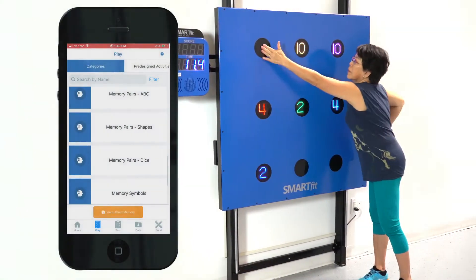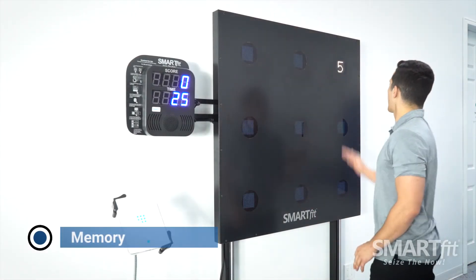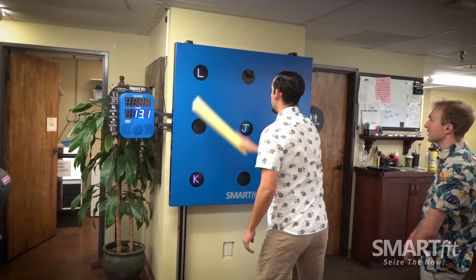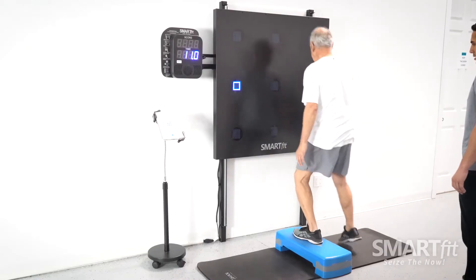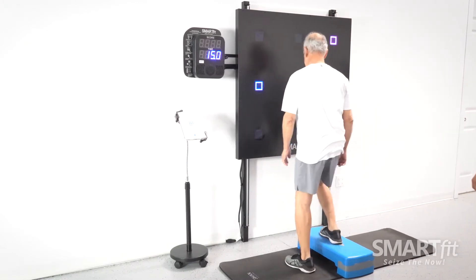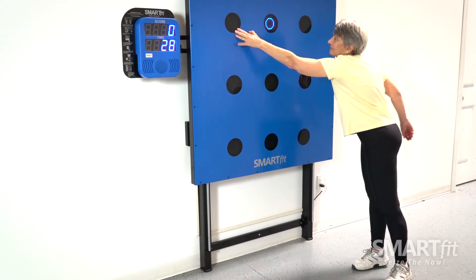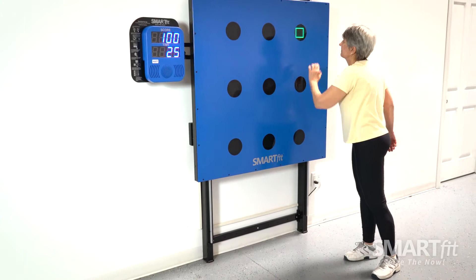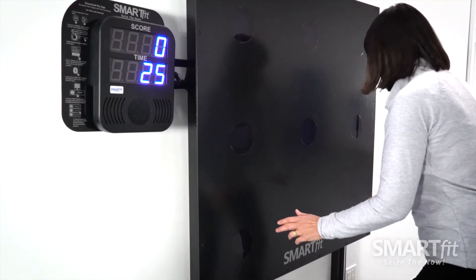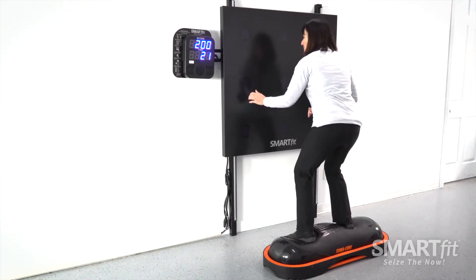This type of category will begin with all target screens turned off. The player must touch two targets at a time to find the matching pairs or correct sequence. In order to perform well, the player must memorize the target screens they strike and return to them when the matches are found. Memory categories are more likely to place greater demands on short-term or working memory. Depending on the complexity and type of memory category selected, different aspects of working memory may be demanded.